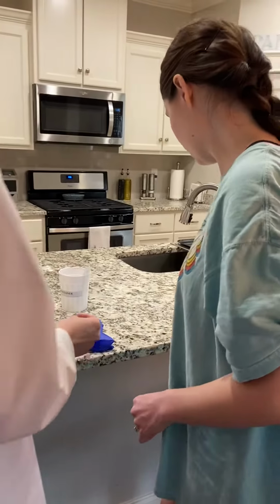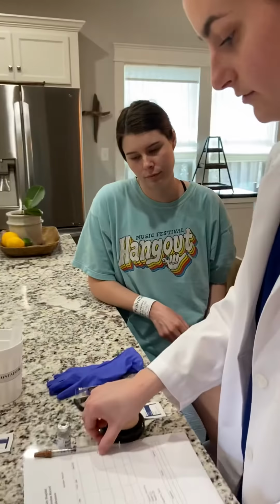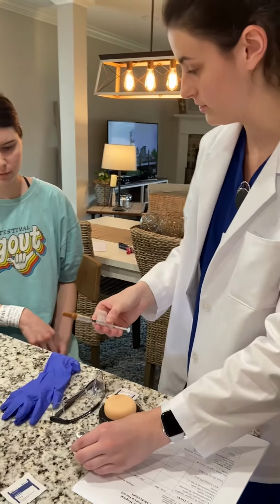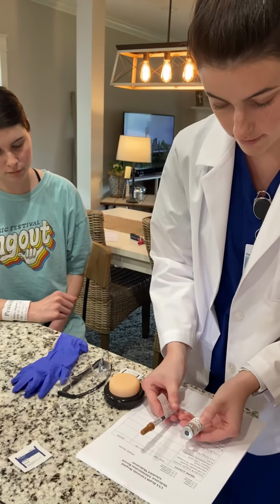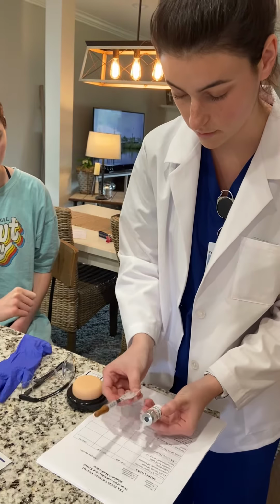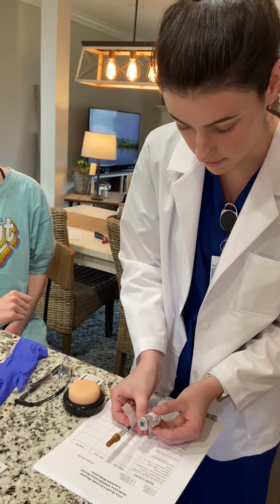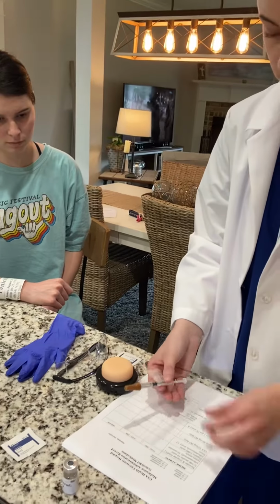Okay, so now I'm going to administer my medication, but the first thing I'm going to do is make sure that I have the right patient, which I do, which is Jaguar Jones, and that I have the right medication, which is heparin 5,000 units that is ordered, and this is heparin 10,000 units per milliliter, and the expiration date is May 5th, 2020, and this is 0.5 milliliters that I'm going to administer, okay? And I'm going to do it subcutaneously every 12 hours.